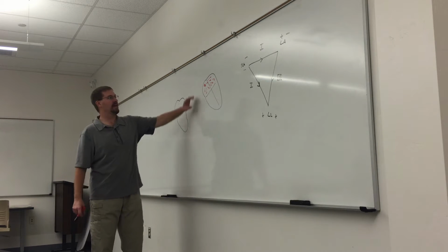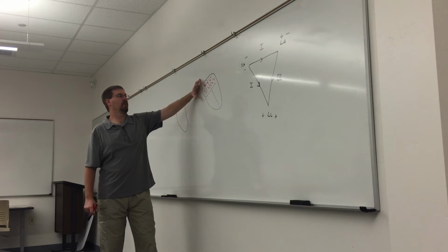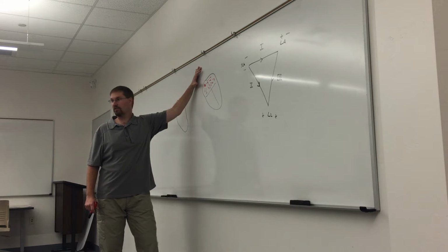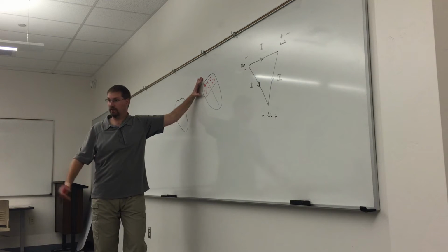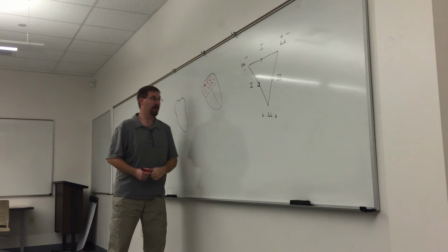And so if you had to guess, is the magnitude of these vectors very large in the atrium? No. Not really, right? Because it's just a little P wave, right? So do you think they contribute a whole lot to the overall vector? No, not really, but they do contribute a little bit.